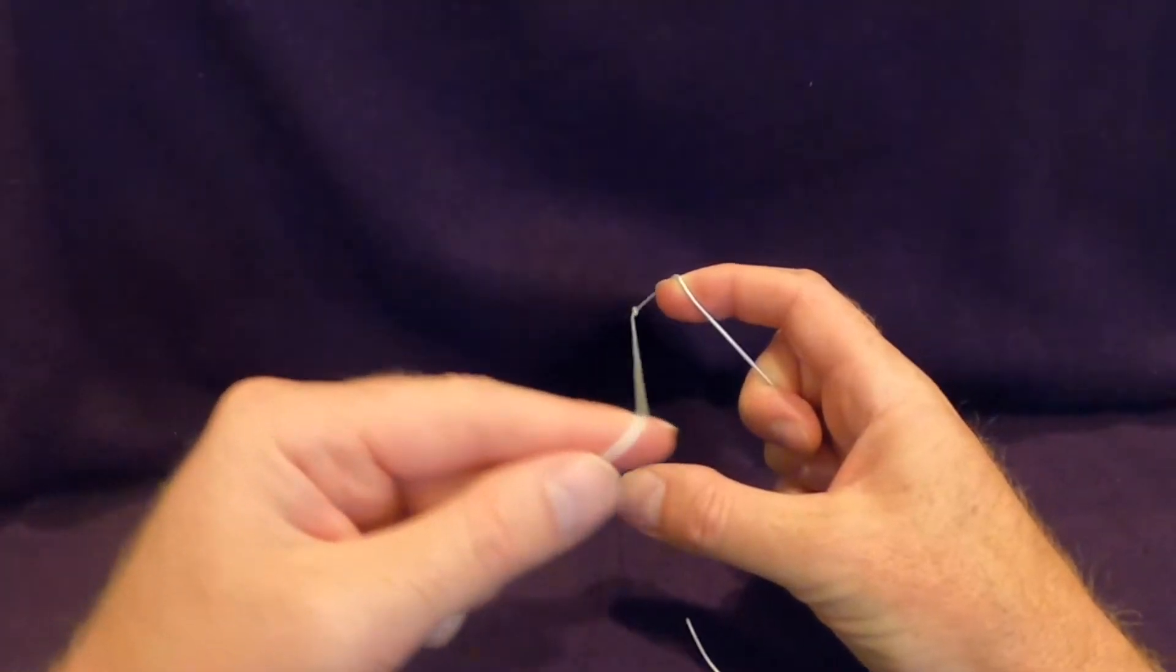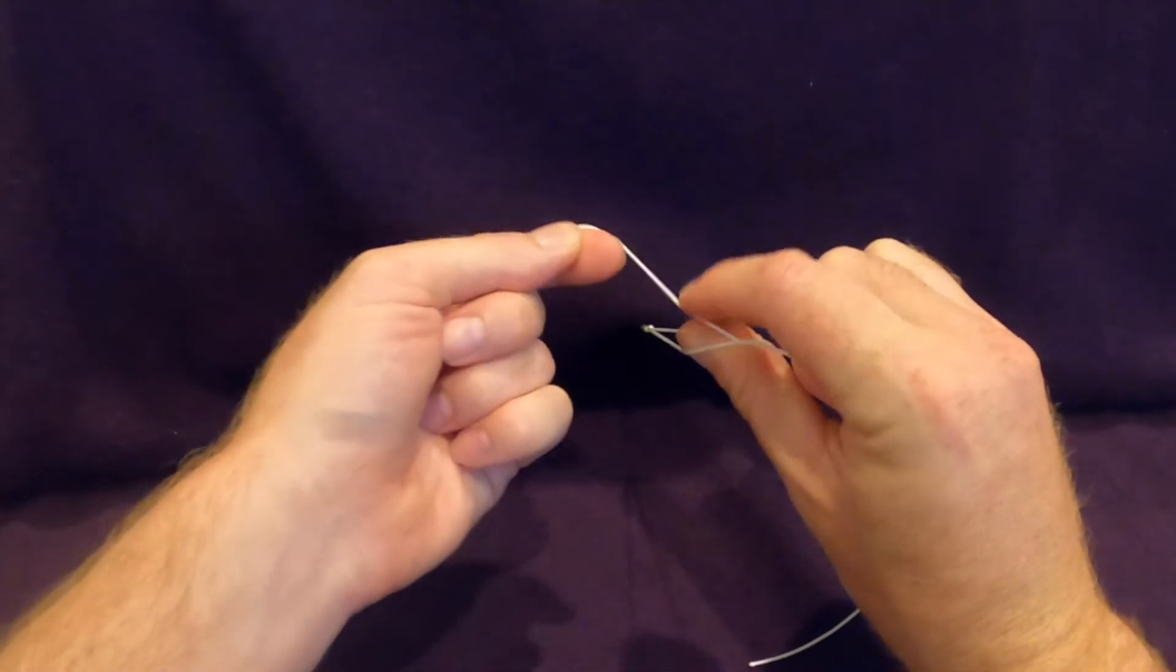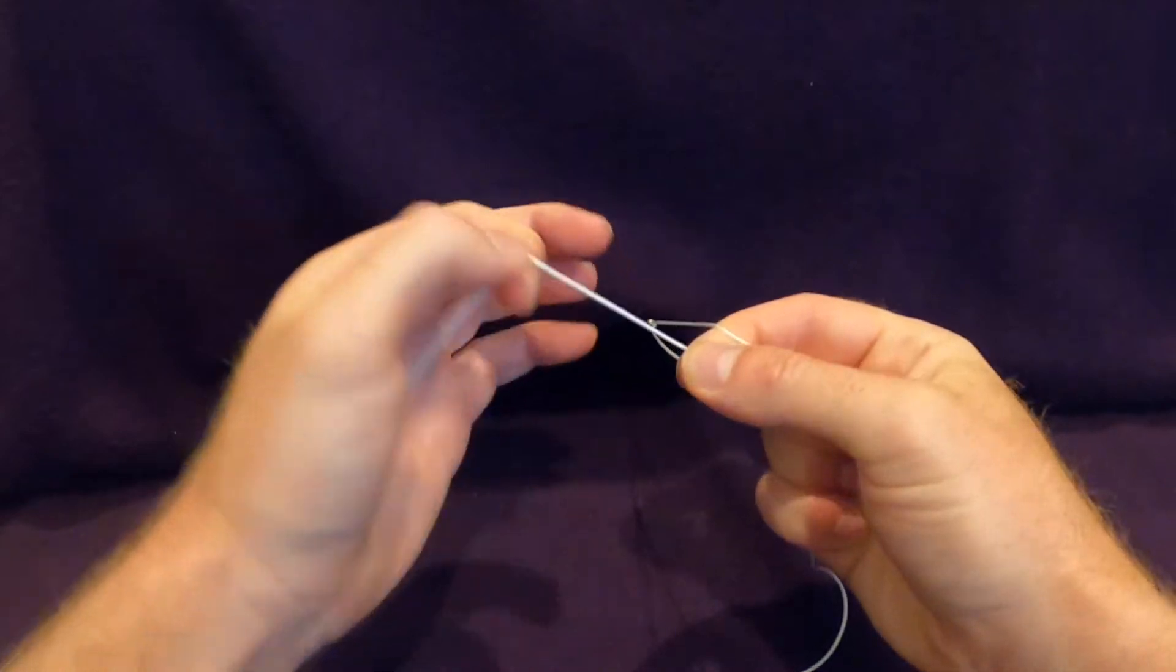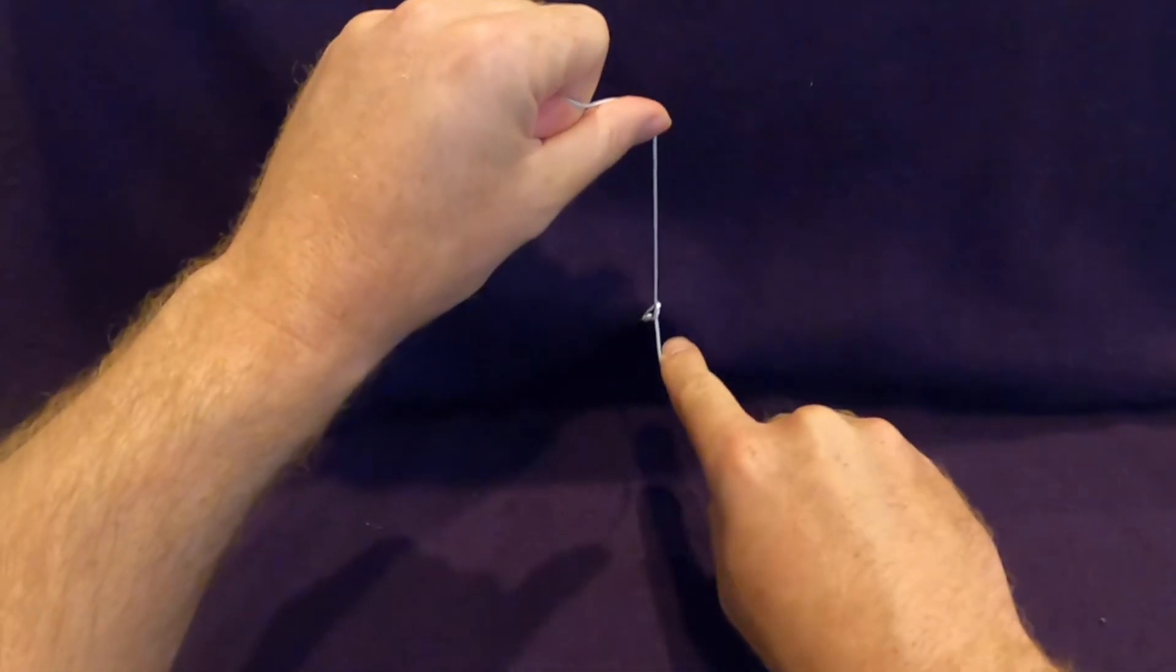We will go through this slowly but watch how the suture tail passes into the C, the fingers rotate, the tail is passed through and pinched by the thumb and index finger and then the knot is cinched down.